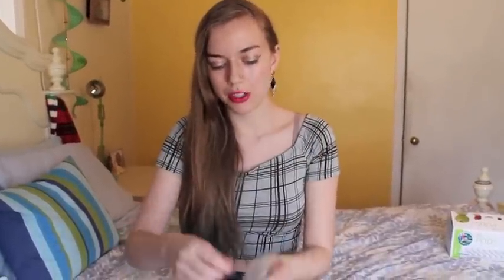So here is the Omnipod I'm about to put on. It tells you that you need to remove this part, and all you do for that is just pull and it comes off. And it says on here that if the cannula, which is the little plastic bit that's going to go under the skin, if that's already popping out, and if you can see it, then you need to get a new pod. So it's not there, so we're good to go.